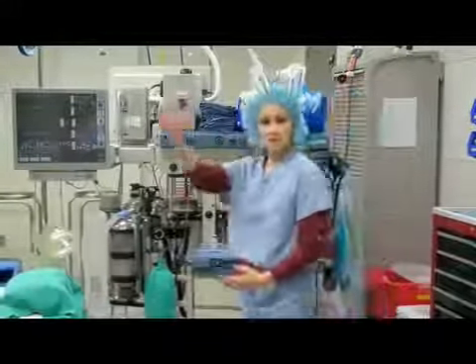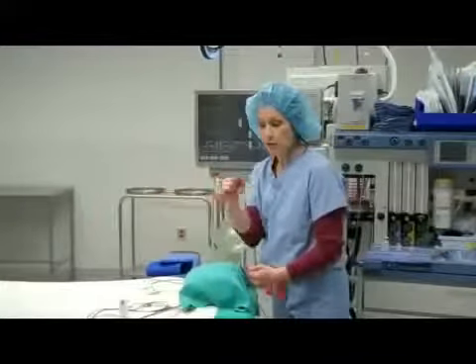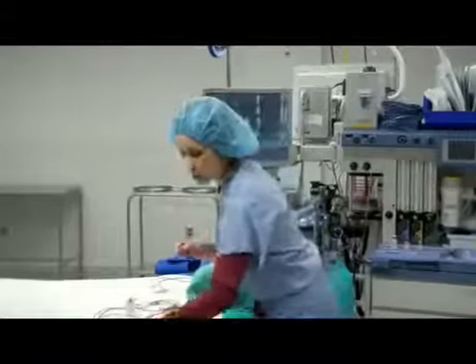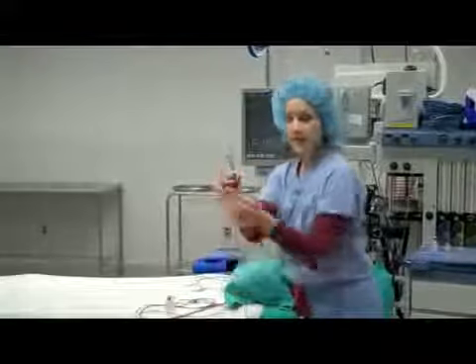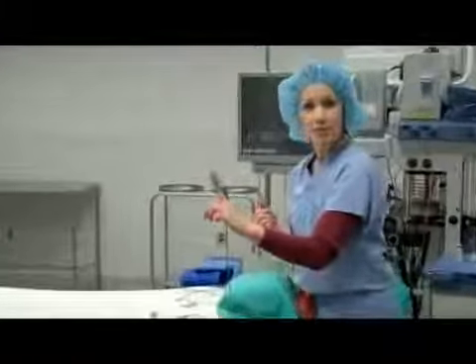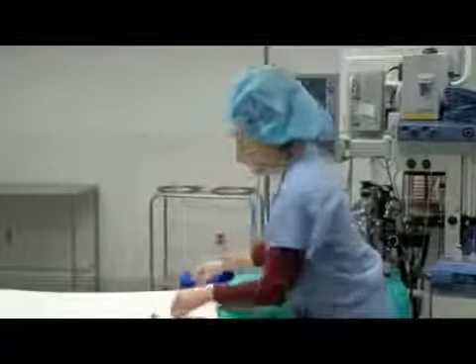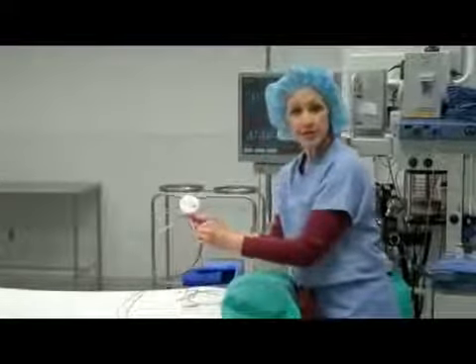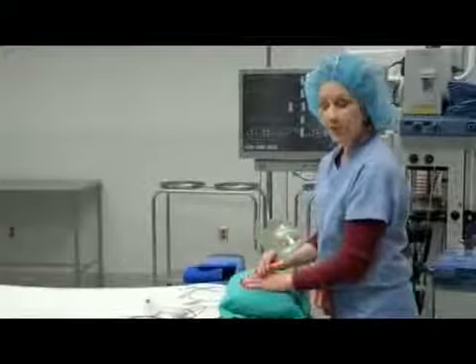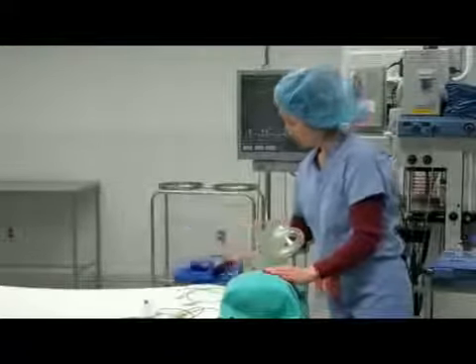We start off by having the patient walk into the operating room. We have them lay on our operating room bed. We then go ahead and start placing the appropriate monitors on the patient. This is a pulse oximeter. It is placed on the finger, and it gives us a percentage of oxygen in the patient's bloodstream. We have the EKG monitors that we place on the patient's chest. It is able to show us a heart rate and a heart rhythm, followed by the blood pressure cuff that we apply on the patient's arm.